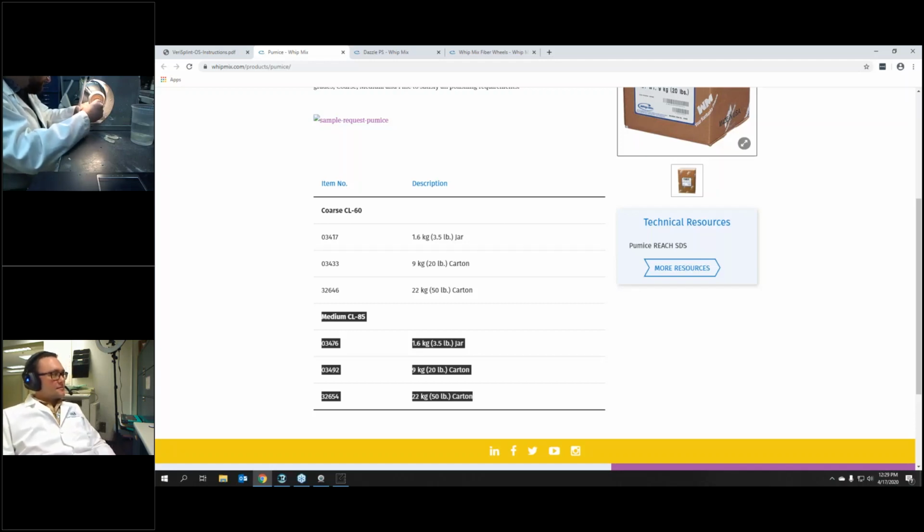How long would you say, when you're not explaining all the different steps, that it takes you to go from the curing unit to a finished polished splint? After the curing unit, I can do 6 an hour, so it's 10 minutes per. I know that from when we went to Chicago for lab day, because we polished up a whole bunch for the AFP hands-on course that we did.